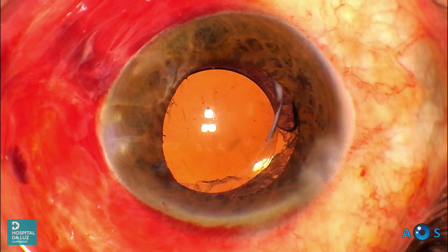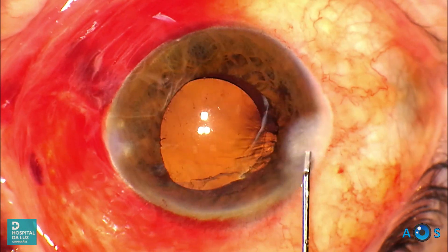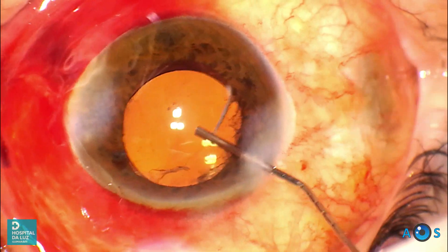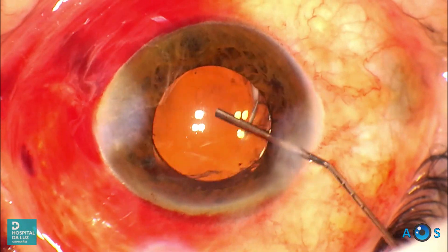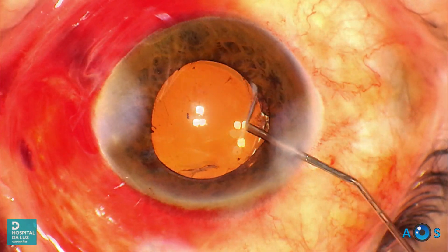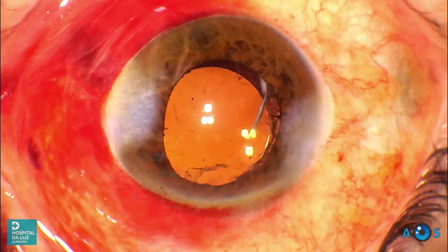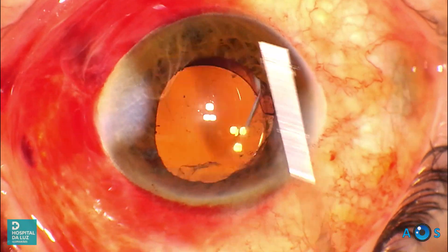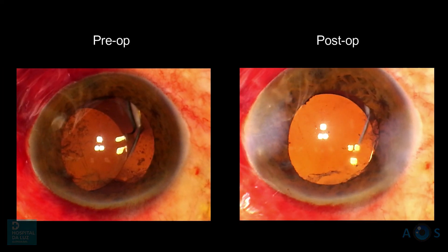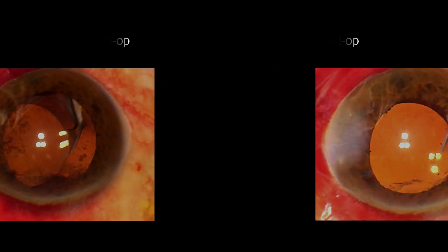The IOL is stable and the capsular bag is looking much better. Time to hydrate the corneal side ports, as the case is now complete. There it is — a simple and precise surgery with a beautiful result.